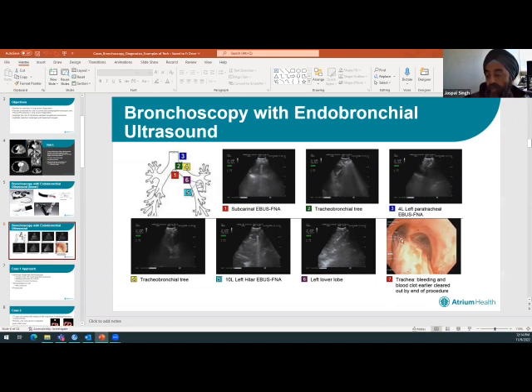I don't see much on the inside. This looks like a sort of empty cavern. But if the airway's out here, you can see this little gray structure. Let me get my pointing tools here. I have to figure out how to work that. Skip it. But then you can see this little gray structure.